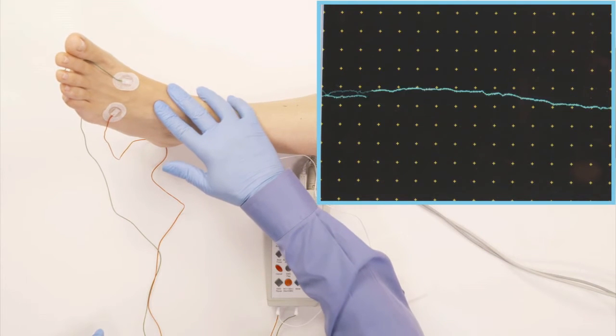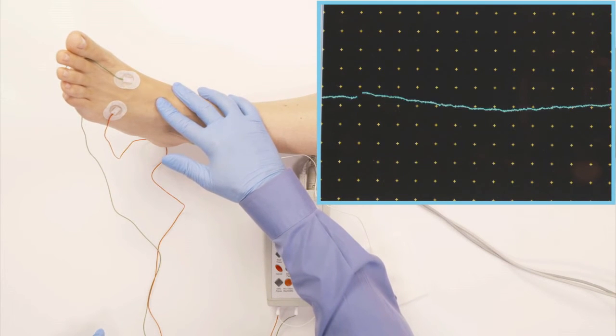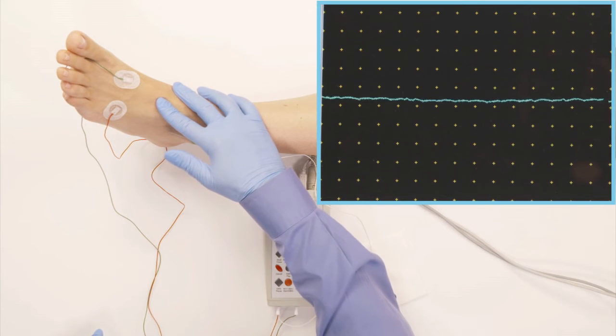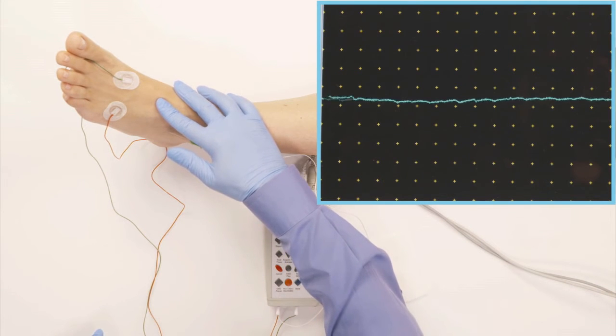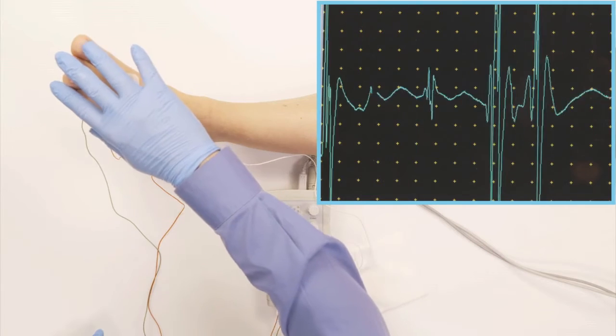And when I put my hand here, you can see that I'm also acting as an antenna, the artifact disappears. So now I'm going to ask her to start activating the muscles a little bit.